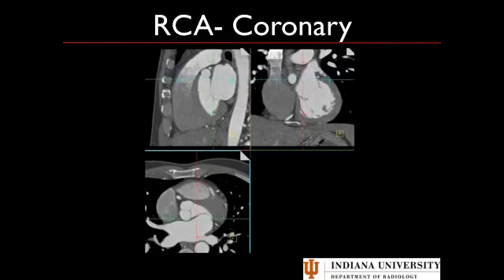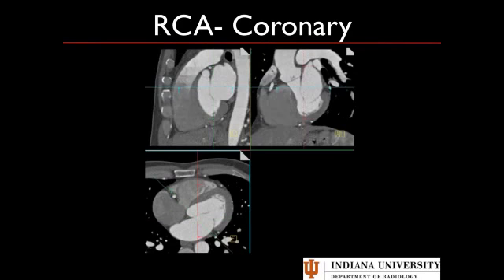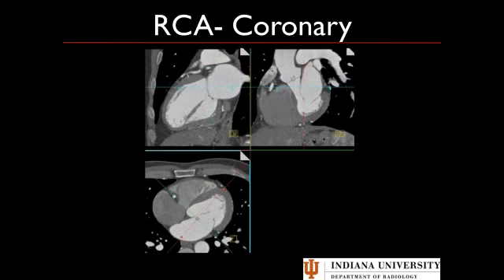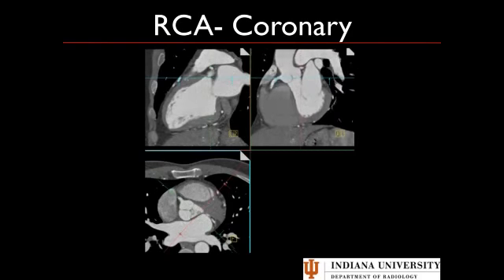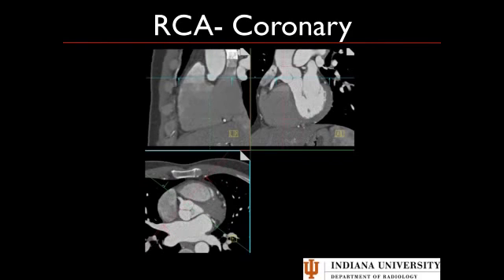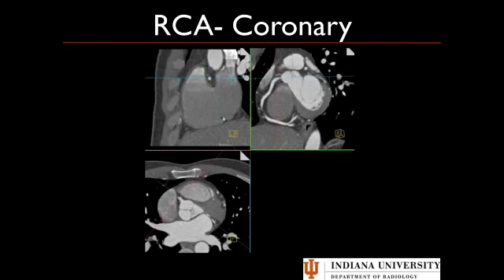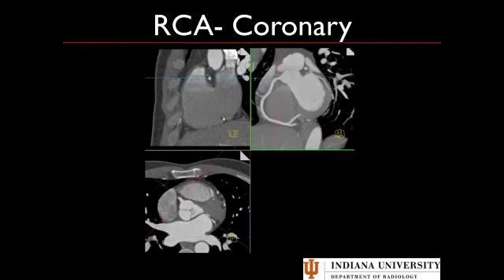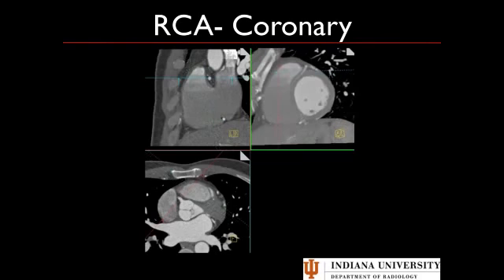I generally always start with the right coronary artery, because it tends to have the most problems with motion artifacts. If I'm happy with the image quality on the RCA, I know it will be fine to evaluate the left coronary arterial system. We line up with the coronary artery on the axial image, angle the green line to lay it out, then add a little thickness to make a thin MIP. In this patient, you can see a very nice C-view of the right coronary artery in just one image.